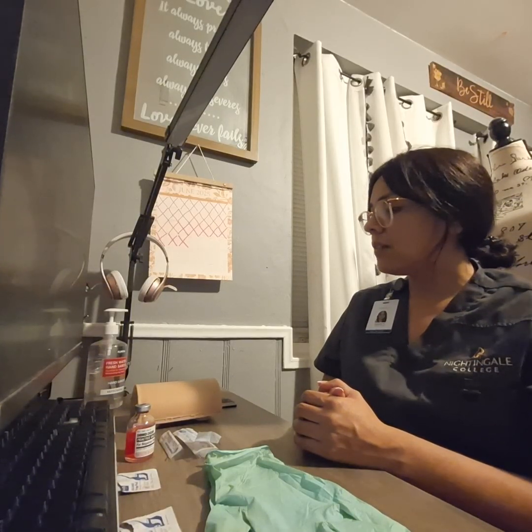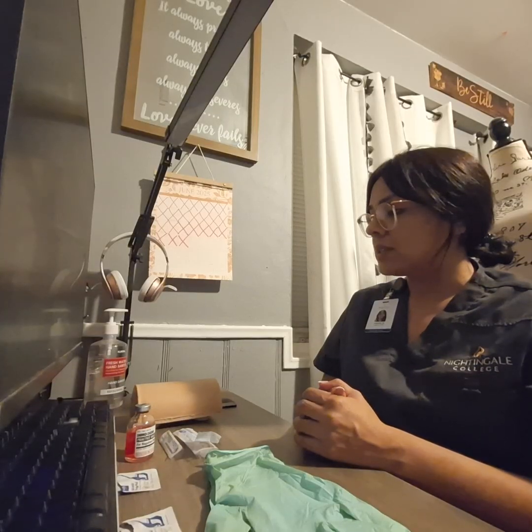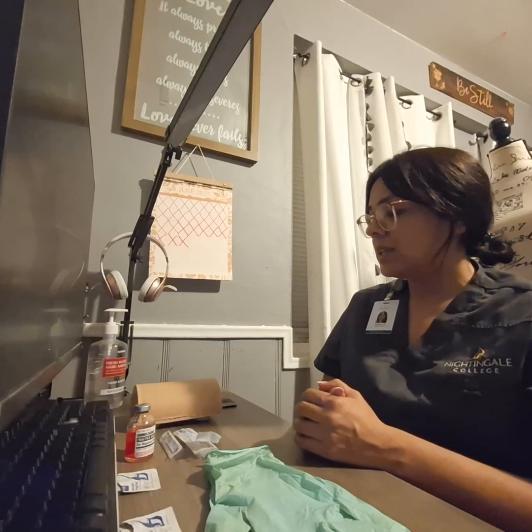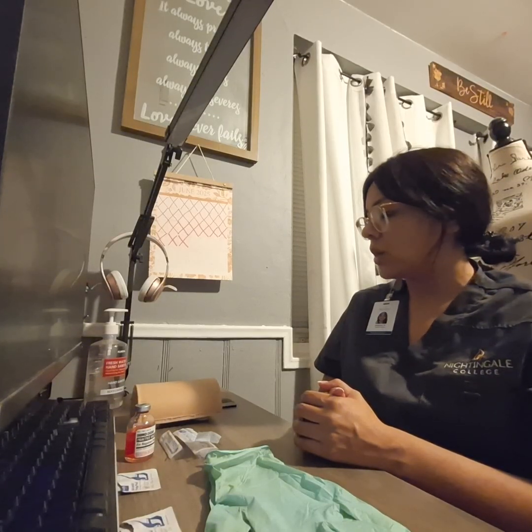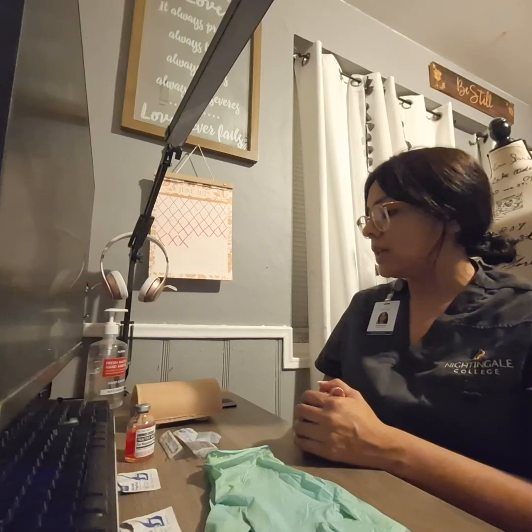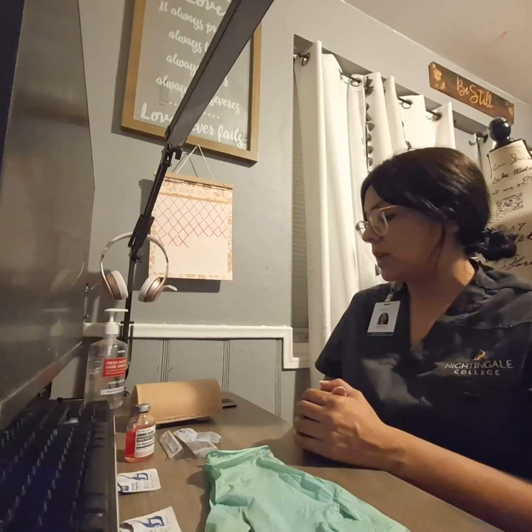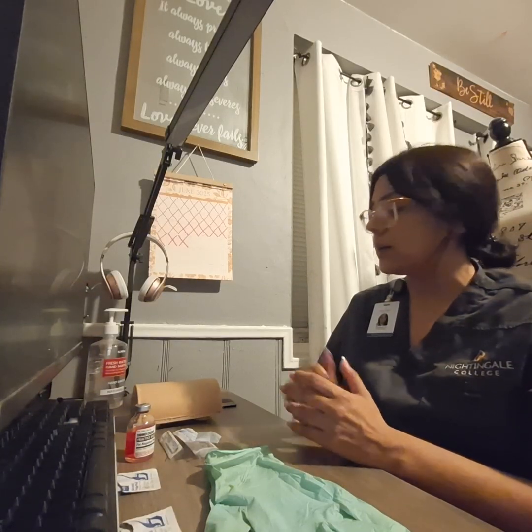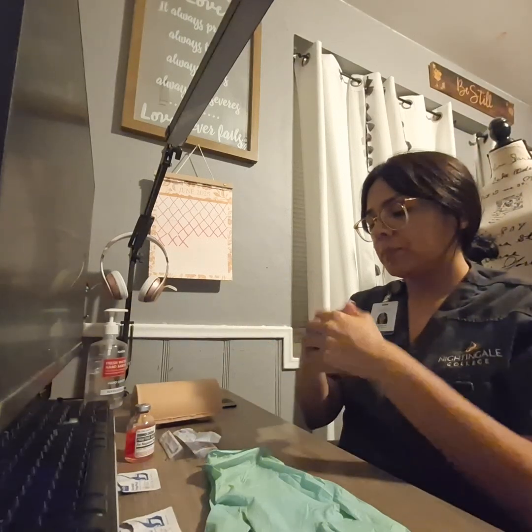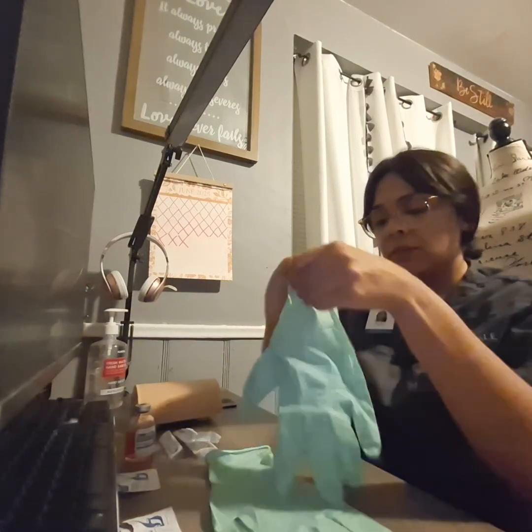Some patients have complained about a stinging sensation or burning in the area, so please be aware of that. Do you have any questions for me? I know that's a lot of information. Okay, so I'll go ahead and perform hand hygiene and I'll apply clean gloves.